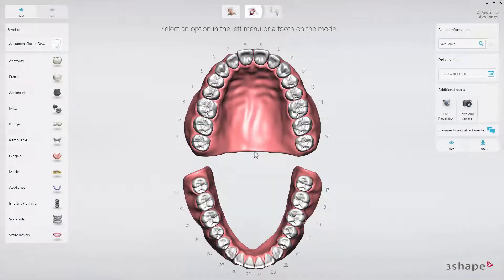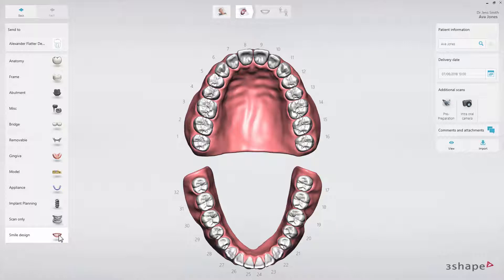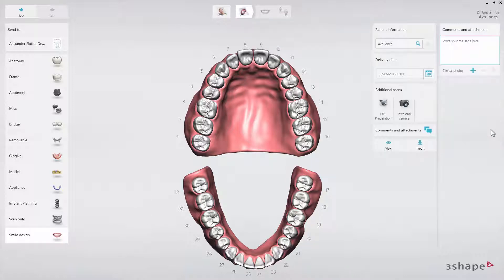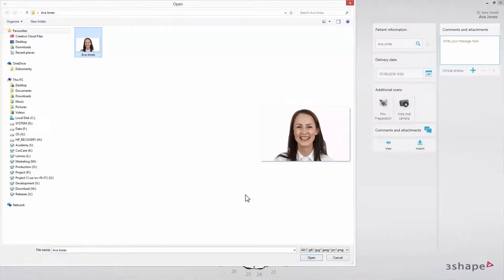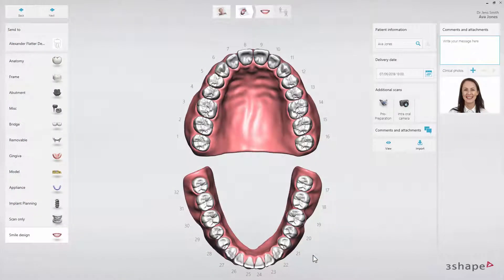While in the order form, click the Smile Design icon and then go to Comments and Attachments to upload the patient photos. Photos can be sent to you by the dentist via email, by 3Shape Communicate, or in other ways. Import the photos and move to the next step.